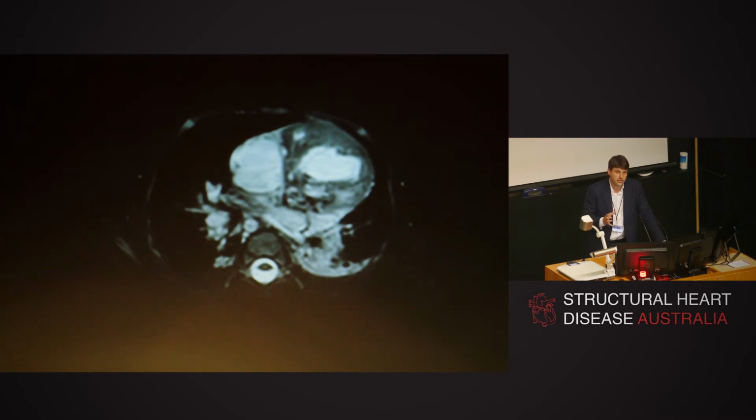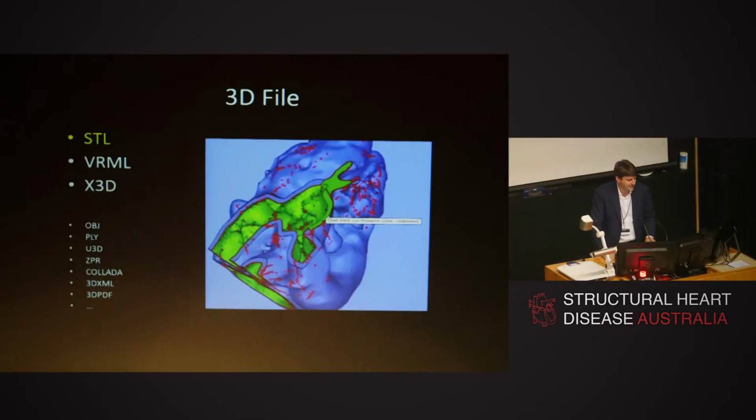So the 3D printing, particularly in this scenario, is not something where you can just press print and something will come out. You need to have expertise and supervision, particularly in areas where what you produce is critical. And as I can say from experience, surgeons don't like it when there's a VSD in your model and there isn't in real life, or vice versa.